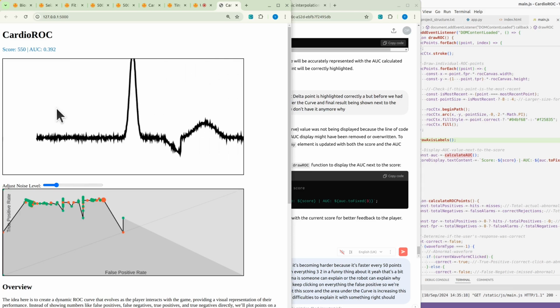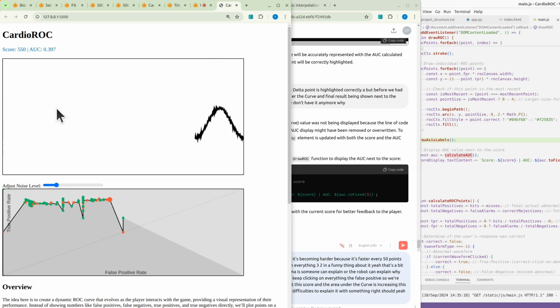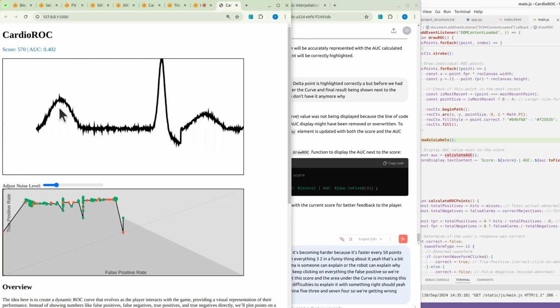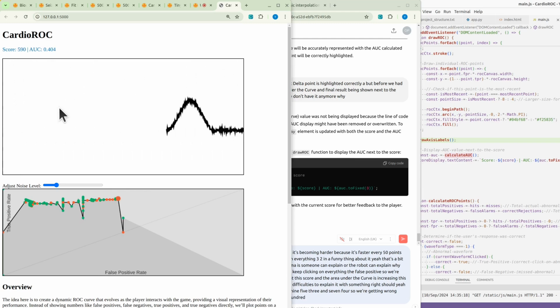Now for example, if we get another 395, 397, 4, so we're getting wrong responses. 560, 570, 580, 590, 600, 590.